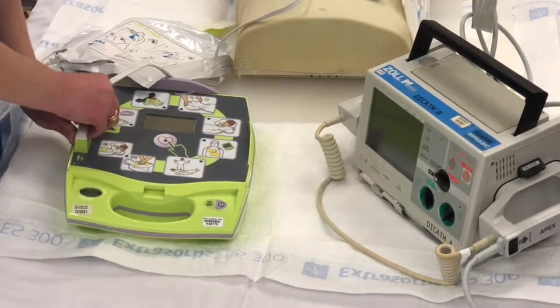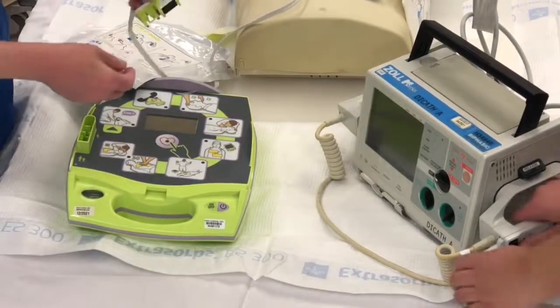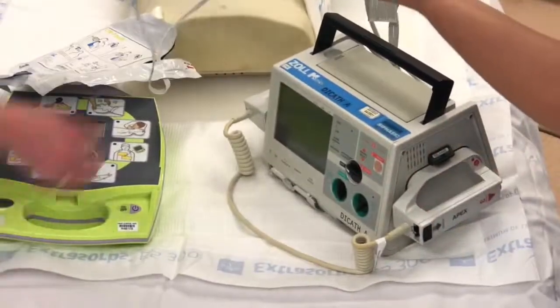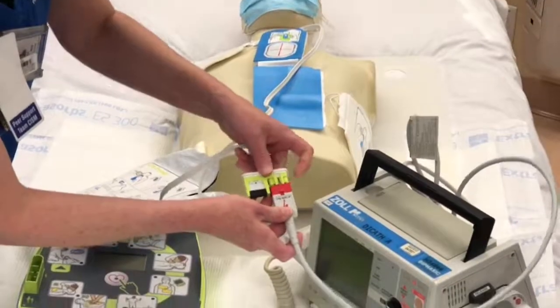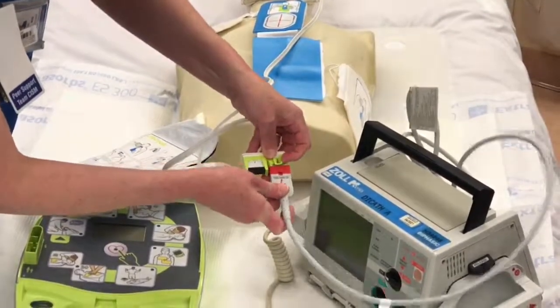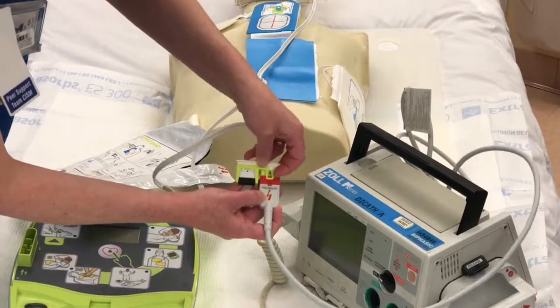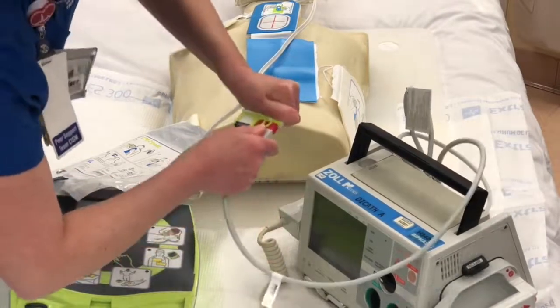So I'm going to remove the pad from the AED. And we're going to show you how to remove the multifunction cable from the paddles and insert it, this side up with your shock symbol, opening up this clip to click into the defibrillator.